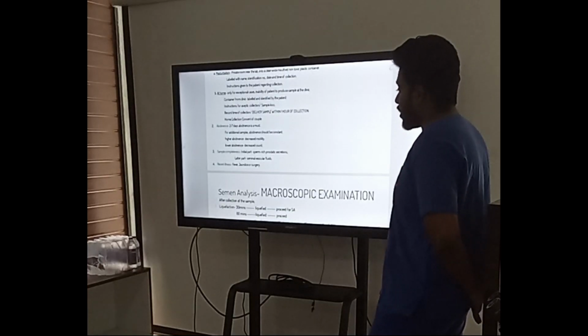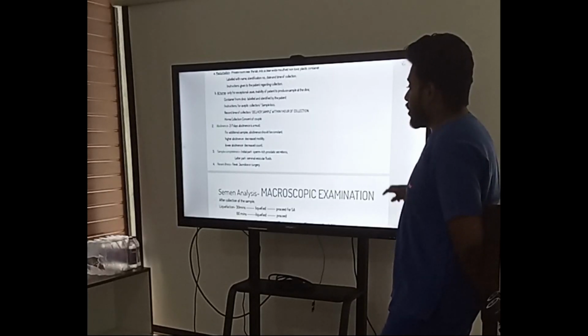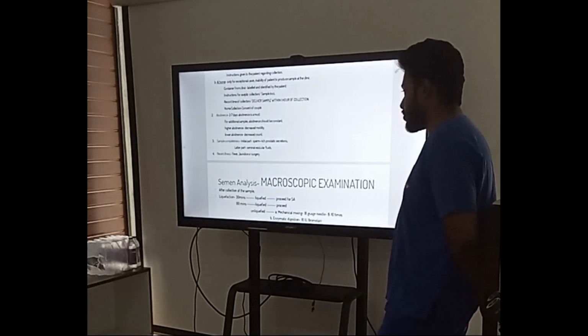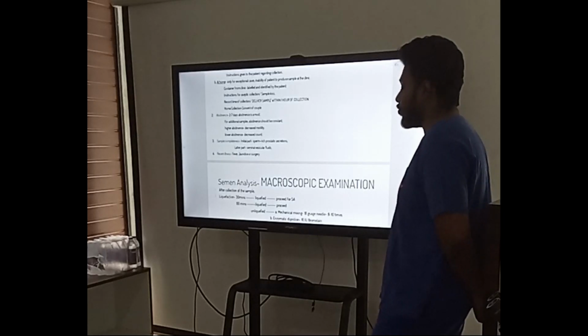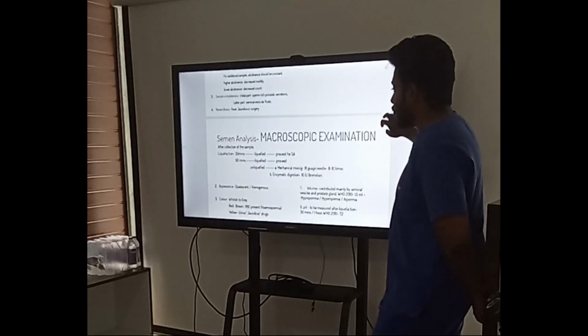Those are the initial and last parts of the sample, as I have told you. And recently, if the patient is having fever, jaundice or surgery, it is advised not to go for a semen analysis at that moment, because it will give you a biased report.